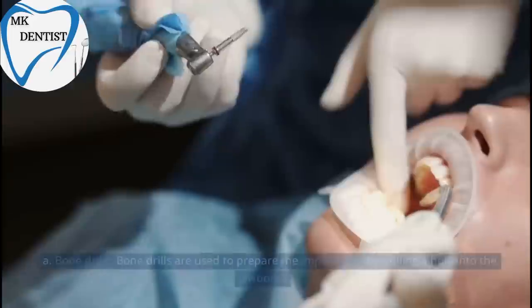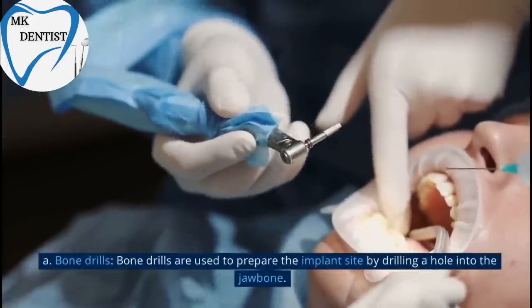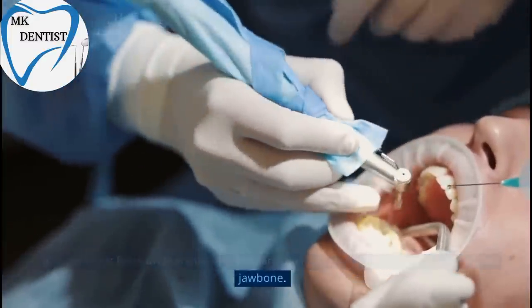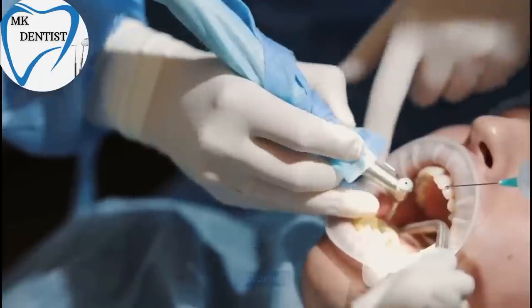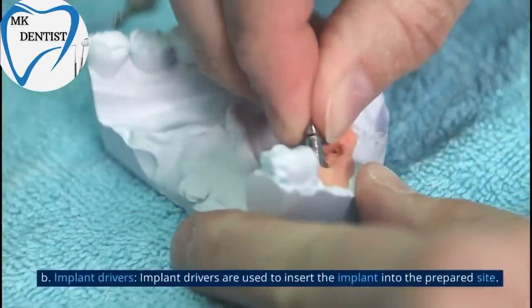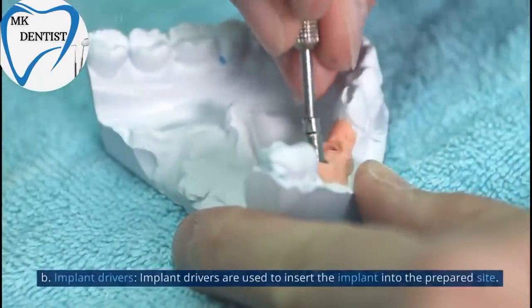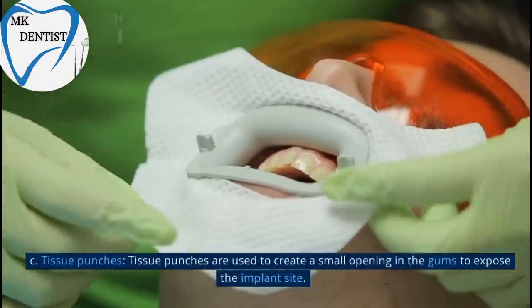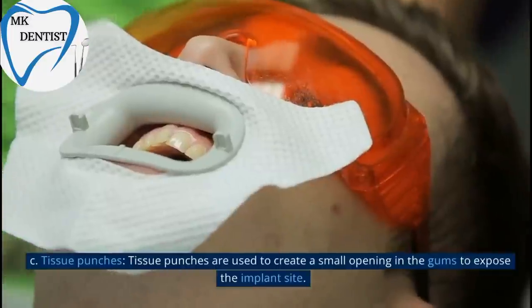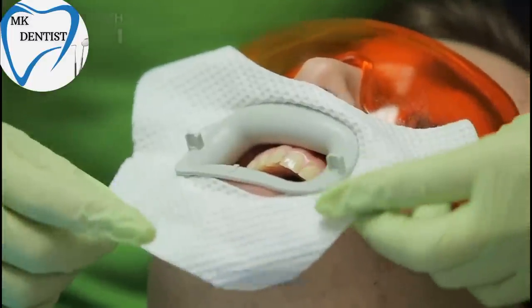Surgical Instruments. A. Bone Drills. Bone drills are used to prepare the implant site by drilling a hole into the jawbone. B. Implant Drivers. Implant Drivers are used to insert the implant into the prepared site. C. Tissue Punches. Tissue Punches are used to create a small opening in the gums to expose the implant site.